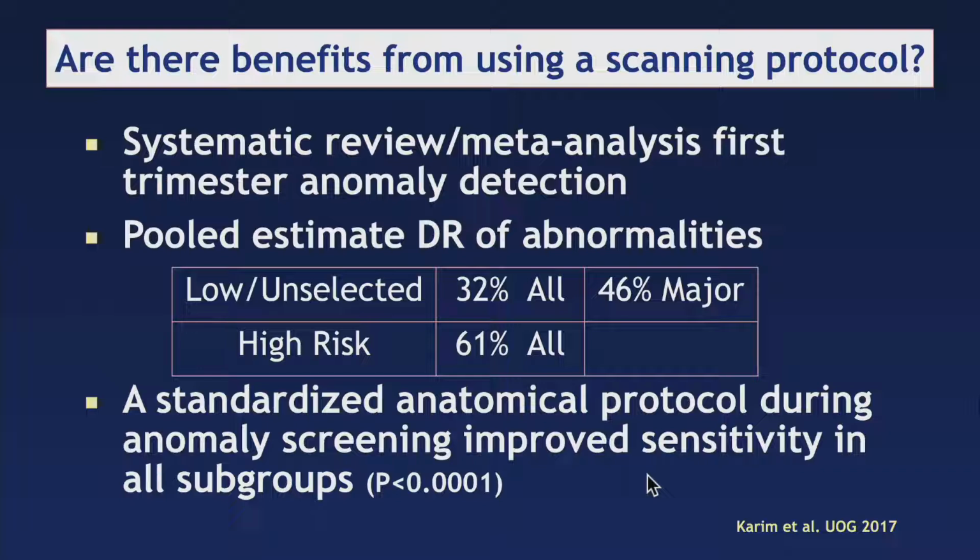And why is that? That's one of the basic things about screening. For example, if you're looking for a bladder and you see it, great, that's awesome. But if you can't, well, you might say, I tried. But you might as well not try, because if you don't see a bladder, you need to follow it up, because your detection rate will be the same as someone who doesn't even look. And that's why we need to follow a standardized protocol.